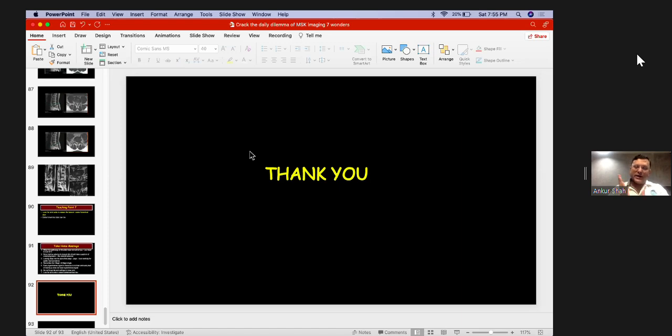Or if you take a 3D sequence in MR, maybe that will help you to take a proper end-on image. Now, even with those ultra short TE images, which give you an image just like a CT scan, it becomes much easier to detect those subtle fractures also. So we can surely measure it on MR, but on CT we can make those coronal and sagittal reformats much more accurate.